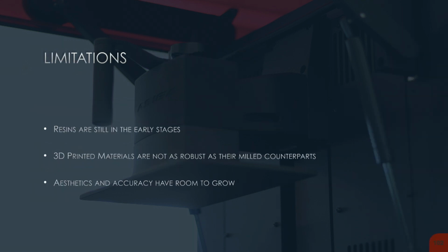You can also use glycerin, but the trays for the Auto Flash have these little holes that won't hold the glycerin, so you have to find a slightly different container. But glycerin works as well because it allows all the light through, but it also creates an inert environment.